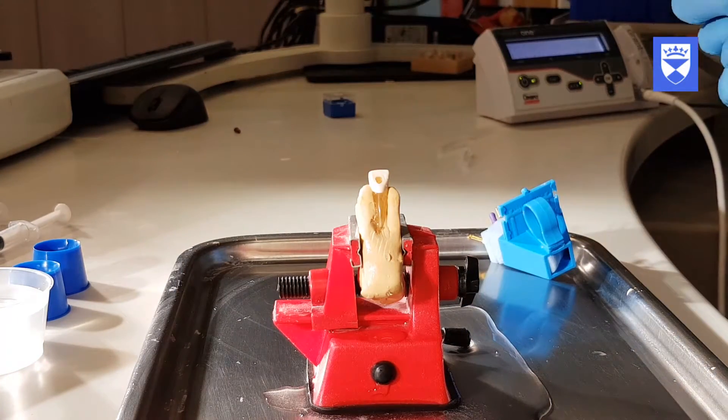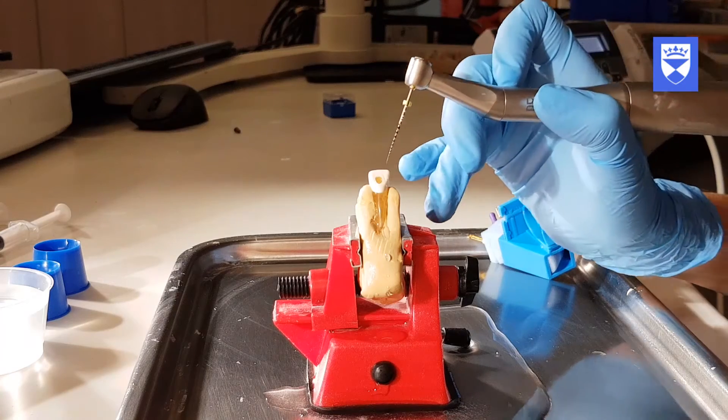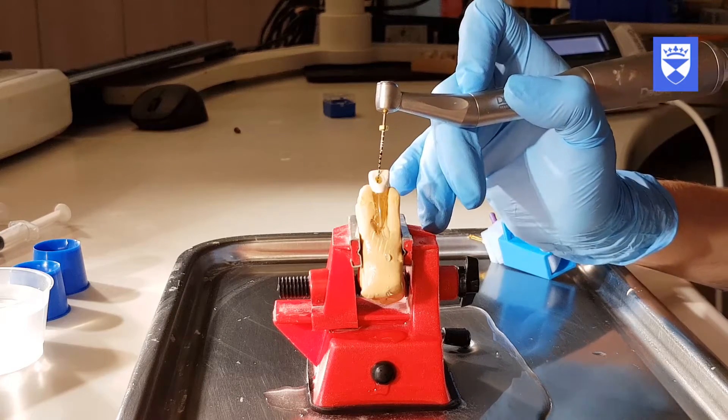Once the canal has been shaped, it is time to use the finishing files, which selectively cut the apical portion of the root canal.